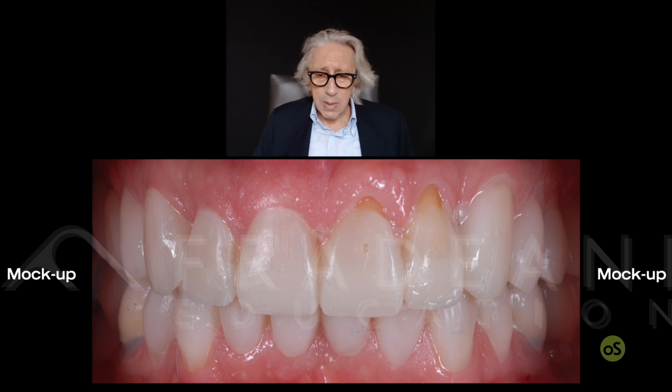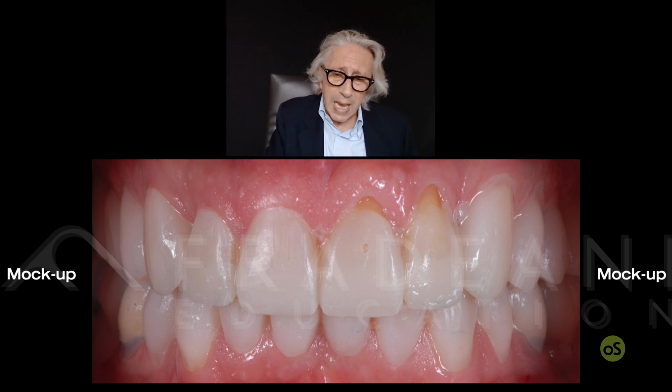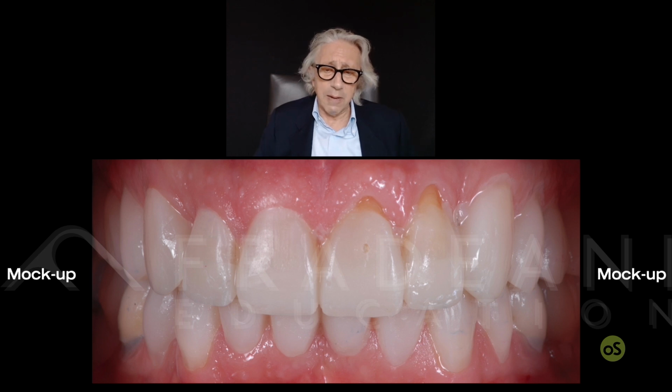But as I said, the result that we achieved with the mock-up was not obtained by chance. It was obtained by looking at all the aesthetic and functional parameters, checking all of them. So we are so happy about what we had as a result with the mock-up. That means we have not started yet any kind of work. I was so happy with the mock-up that we want to copy it to the final, because we have really studied the case in a proper way. The treatment plan was well done. That's the reason why we would like to copy.